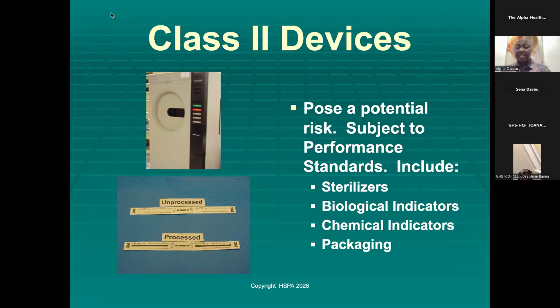Hence, if that particular device does not meet that qualification, that pass from FDA, and you use it through the process, the instrument will not be sterile, although the material will say it passed. But because it did not meet the criteria that it's supposed to meet, the instrument is then used on the patient.